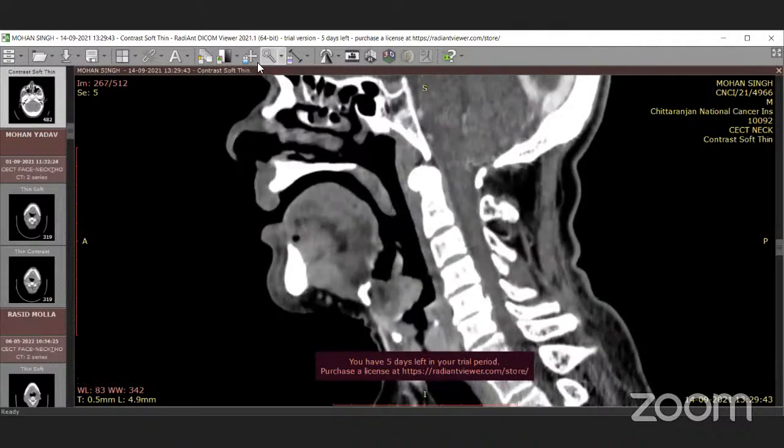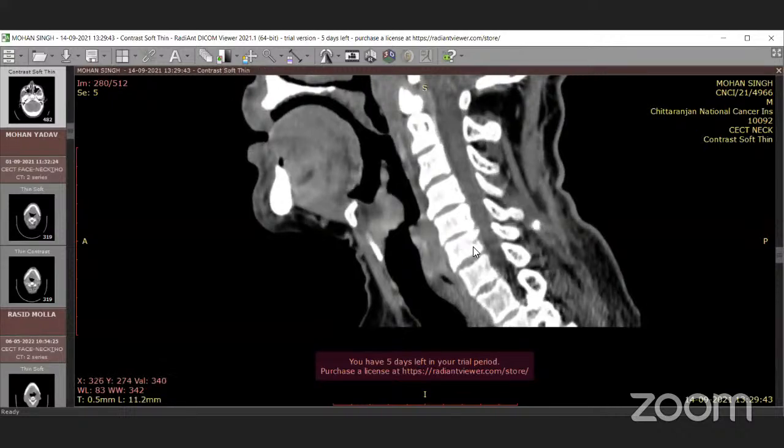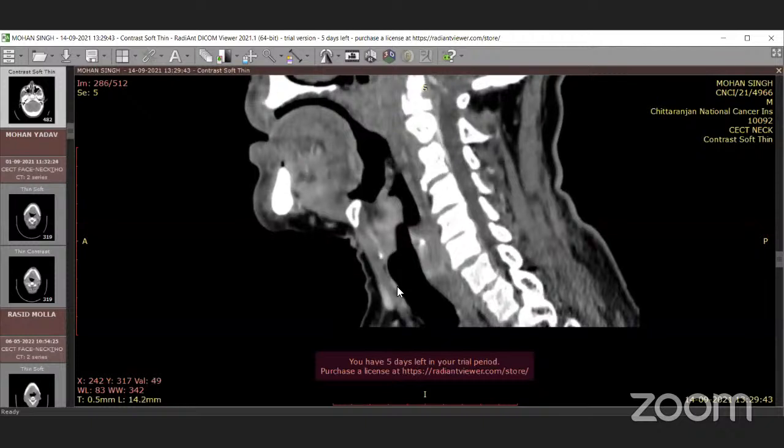So yeah, absolutely fine. This is absolutely fine, Sona, from your side, the levels. Do you want to add anything here in the larynx? Yes, just one more thing, sir. So this is the level of the anterior commissure, and whenever we have anything within 1 centimeter from the inferior margin of the anterior commissure, we are not yet touching the cricoid cartilage.